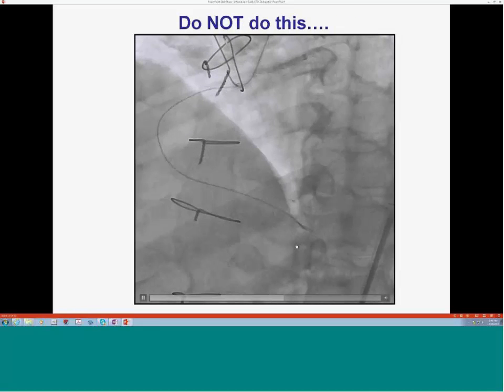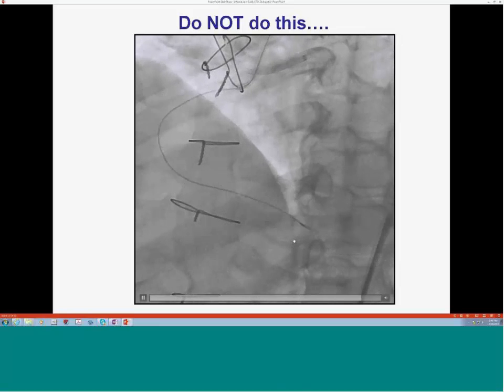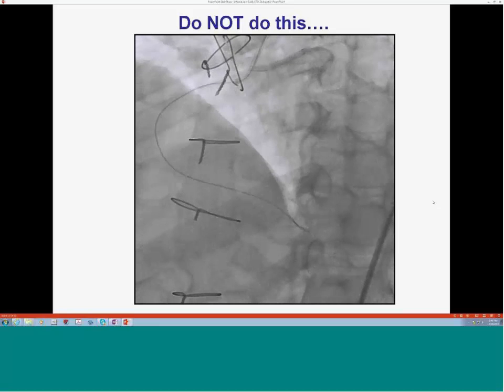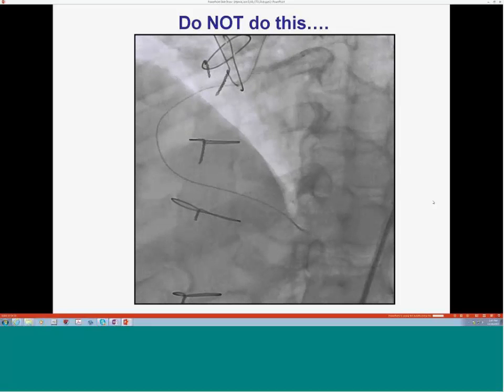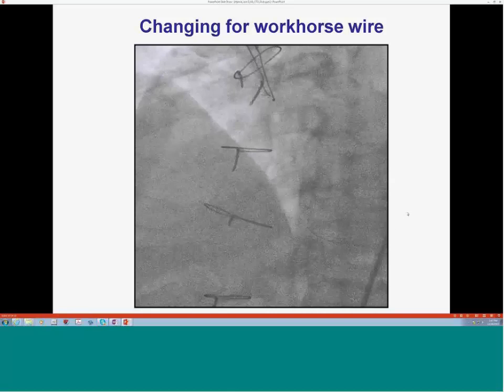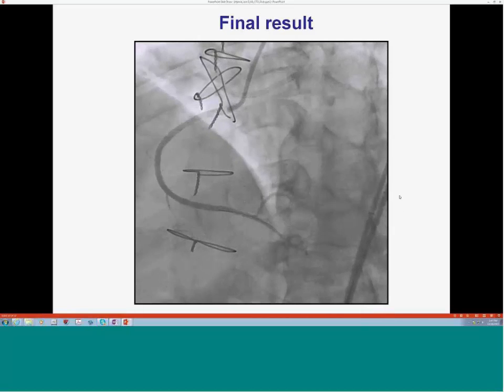And again, most of the CTO group advised against injecting from the microcatheter. I think here we were still a little nervous because it was a very small, diffusely diseased vessel. That's why we did it. But for most purposes, it's best to not do this injection. And then we switched to a workhorse soft wire, whatever workhorse wire you like, and it worked out well.